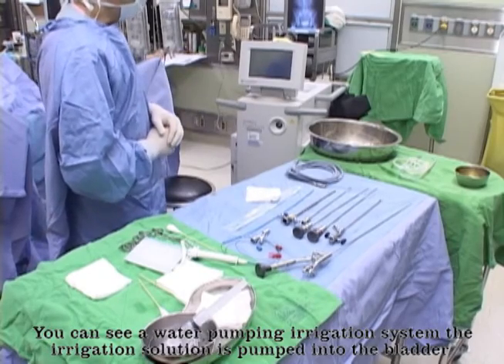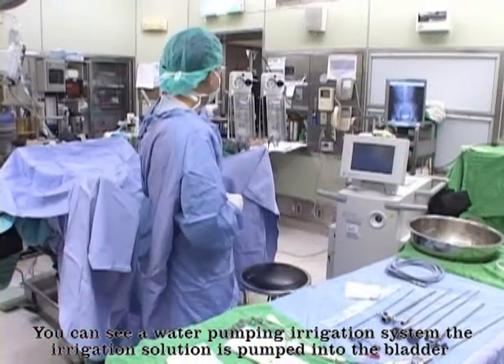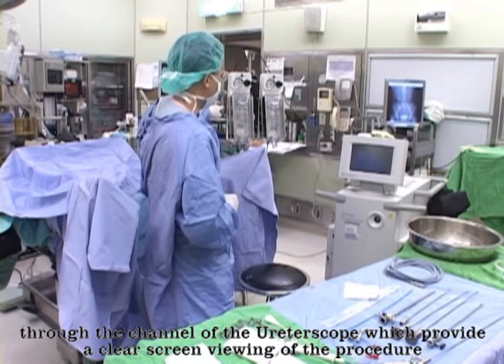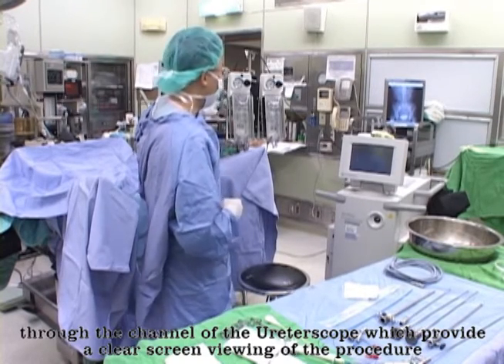You can see a water pumping irrigation system. The irrigation solution is pumped into the bladder through the channel of the ureteroscope, which provides a clear screen viewing of the procedure.